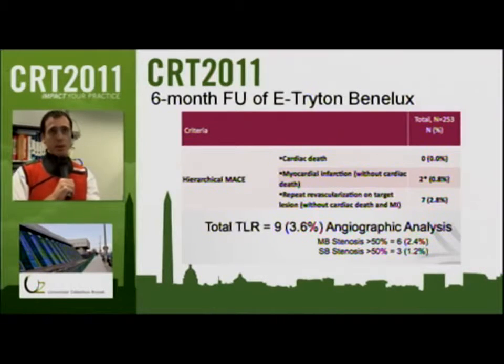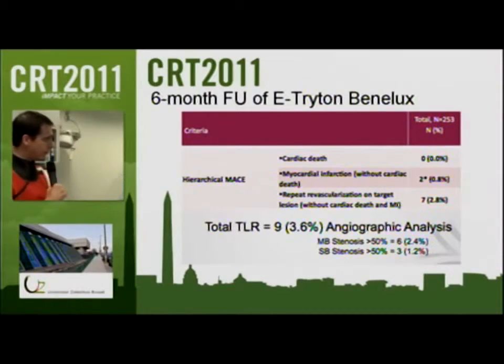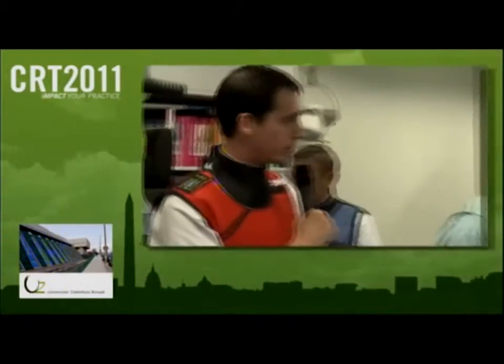Next slide, please. Here you see the results. This is the 6-month follow-up of the E-Tryton Benelux, and as you can see, we have low MACE rates and especially low TLR rates. So I think this is a very interesting case, and let's start with the procedure, please.